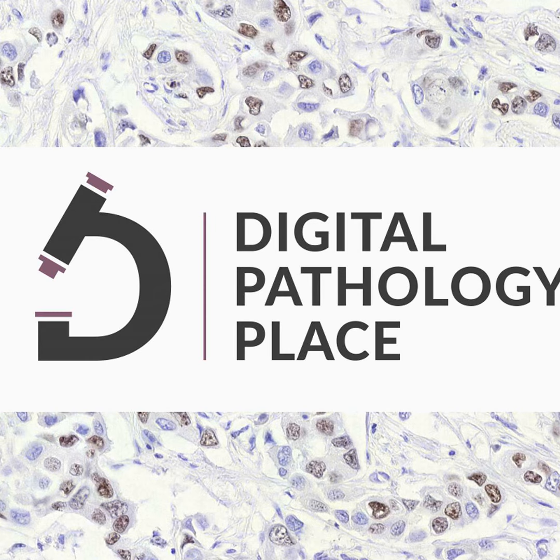The digital pathology slides were just an extra, basically, where they said, well, we have this slide anyway, because they'll scan the slide before they do the sequencing, because sequencing is expensive, making a slide is not expensive, and they want to make sure there's actually tumor on what they're about to sequence. So they'll make an H&E slide, they'll look at it, they'll estimate what the tumor purity is, and say, oh, if the tumor purity is 0, we're not going to sequence it. So they've saved a few $1,000s there, and they'll keep going until they find a sample that they like.